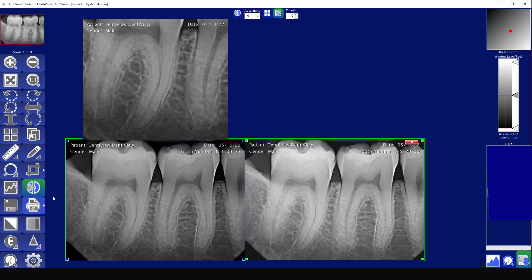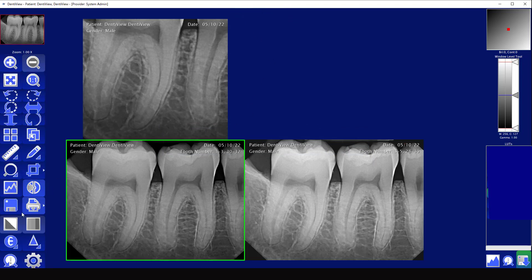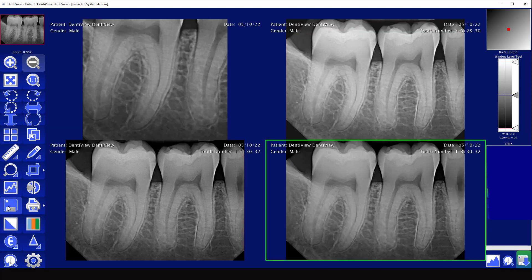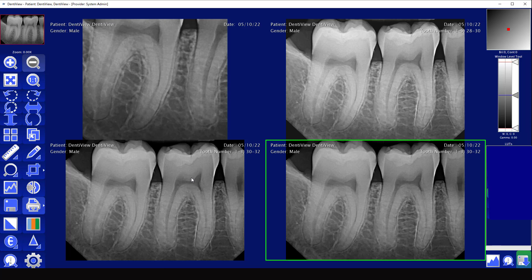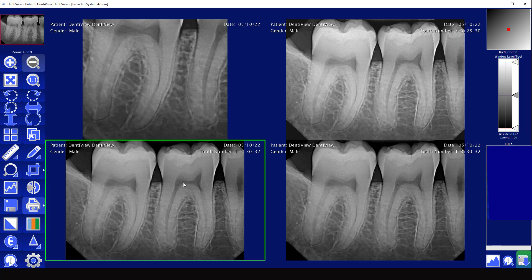The next one is to save an image. If you select one of your images and hit the save icon, it's going to duplicate the image and then save it. That way you have your original and then another one that you can go and mark up with annotations or measurements while still keeping your good-looking x-ray.